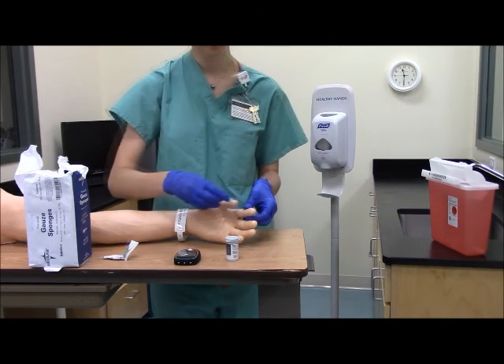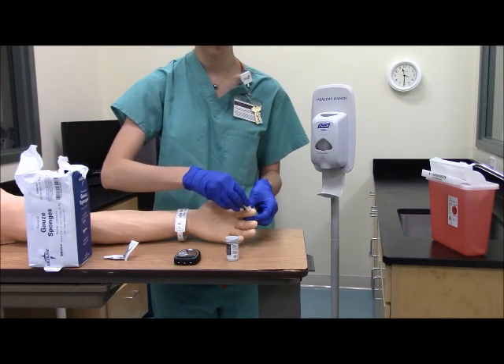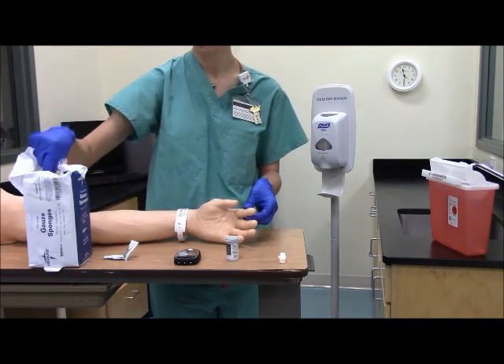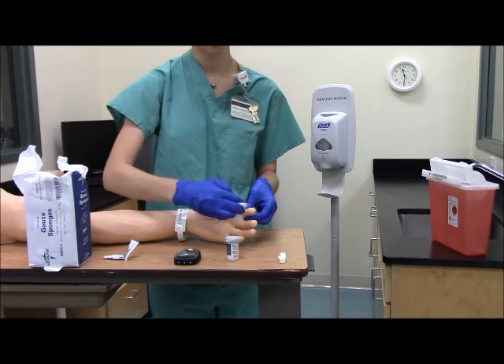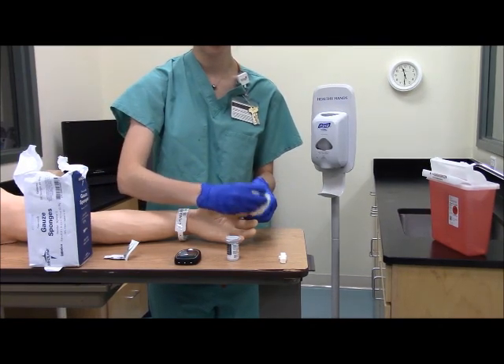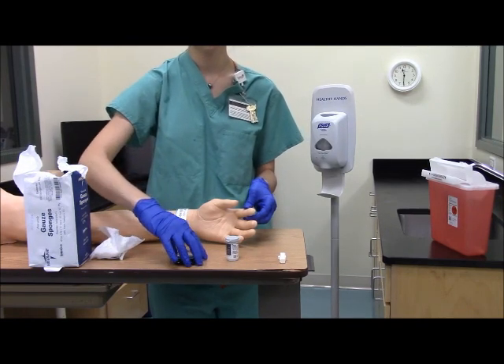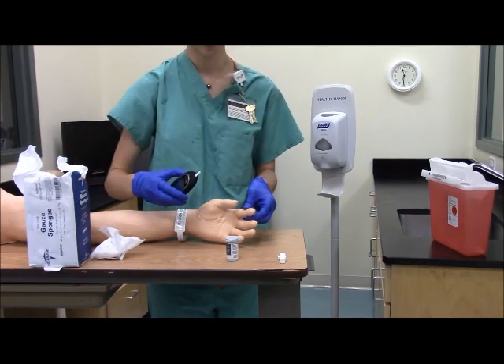Hold the lancet perpendicular to the skin and pierce the site with the lancet. Go ahead and wipe away the first drop of blood with a gauze. Take care not to squeeze the finger, not to squeeze the puncture site, or to touch the puncture site of blood.